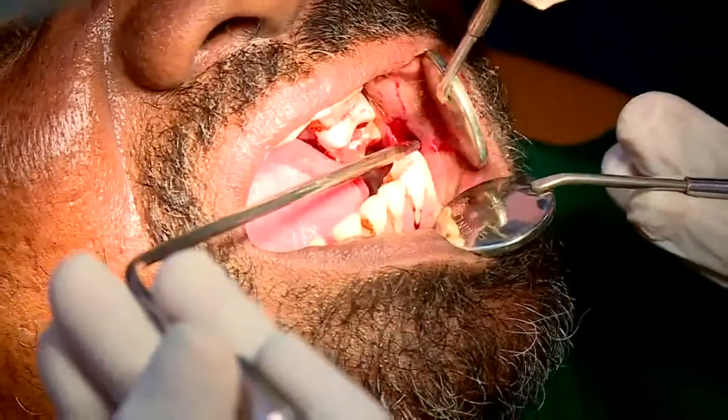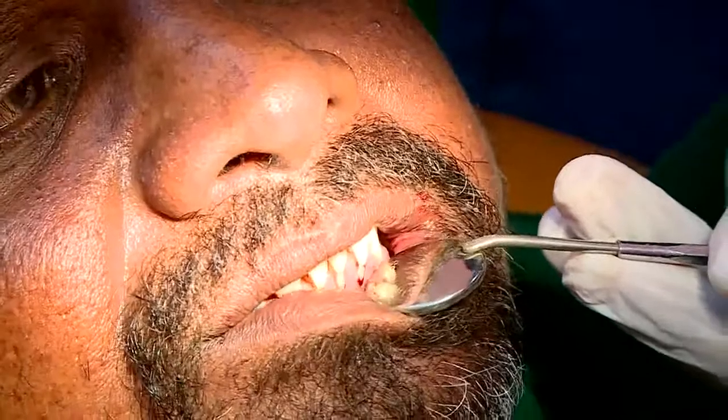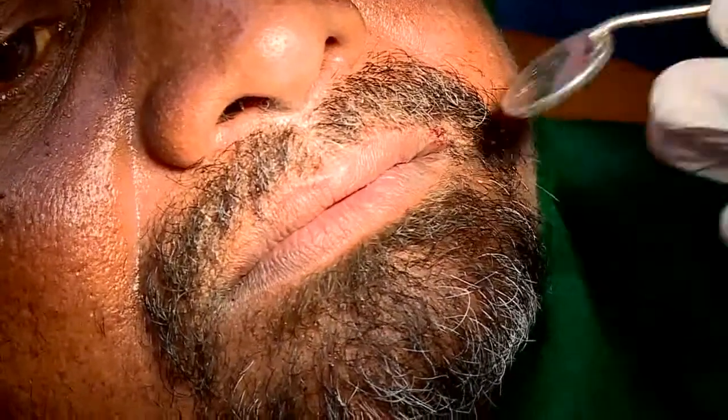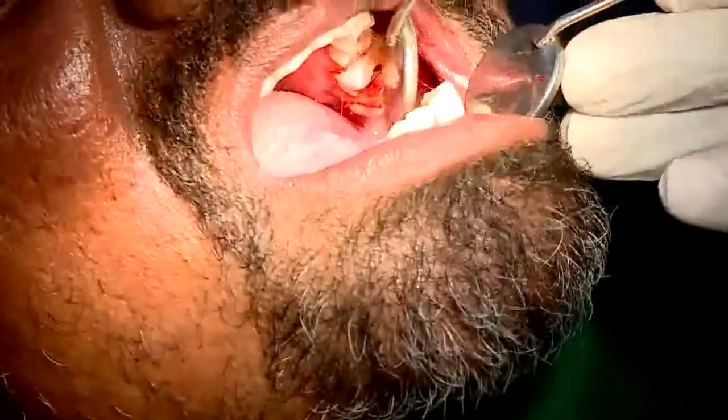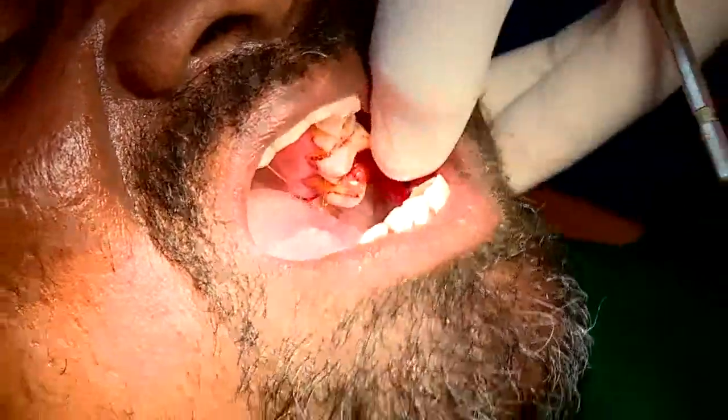And now we need to make a suture to just approximate the defect. And the suture should always be taken in the normal mucosa. Try not to pass the needle through the infected tissue or through the cancerous lesion, because by doing that we are going to seed the lesion into the deeper planes. So always you know that you have taken a margin from the normal mucosa and involve only the normal mucosa in this area.